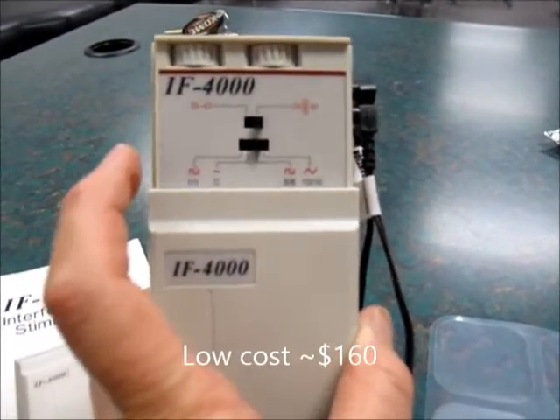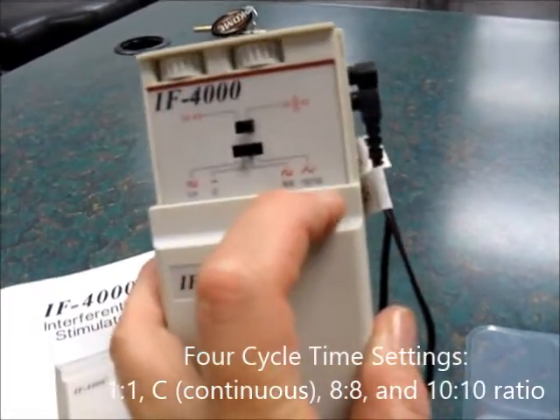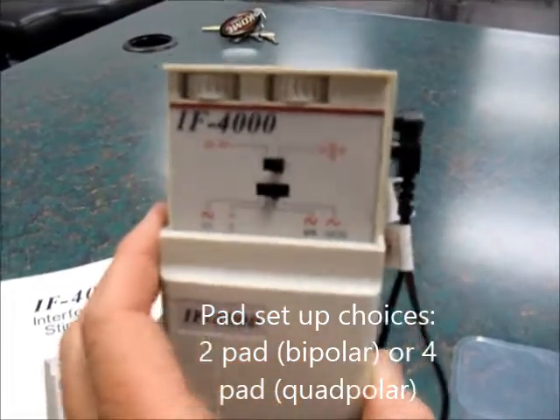You can see that you can set the different settings. Right here you can have a 1 to 1 ratio, C for continuous, 8 to 8 ratio, and then a 10 to 10 ratio. Change this dial here and you can choose either a 4-pad setup or regular pad setup.